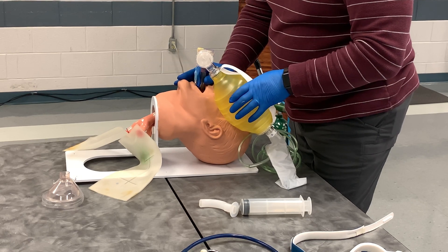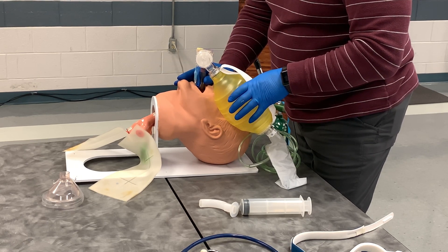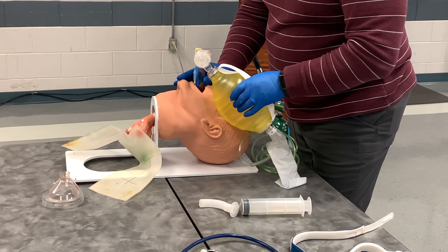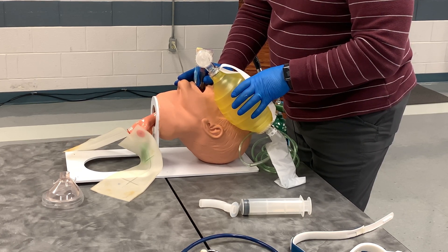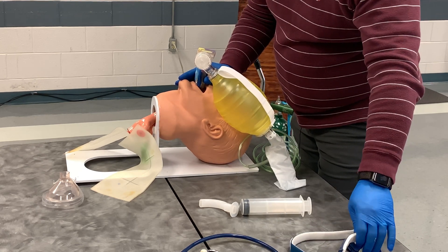I can also verify oxygen saturation — I see that it is now 95%. So I am going to have my partner continue to ventilate at one breath every five to six seconds while I secure my tube.